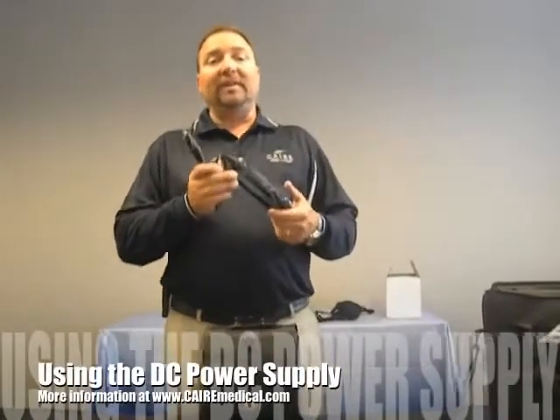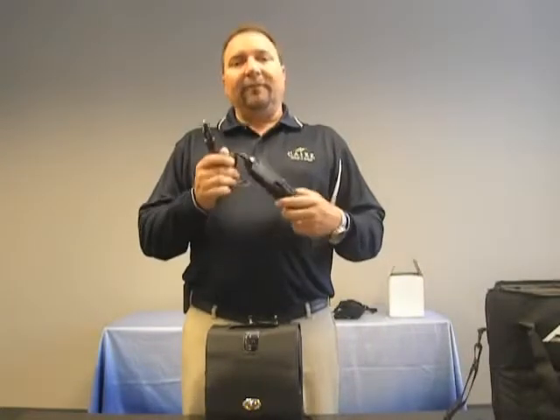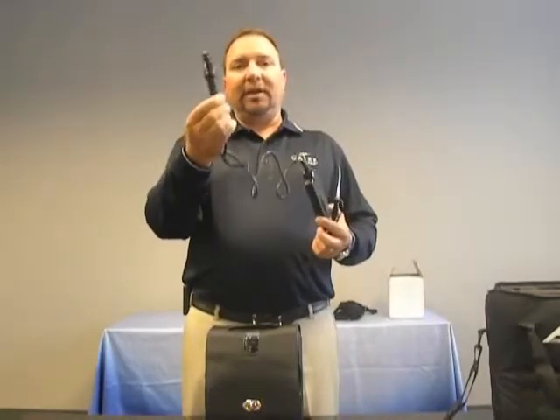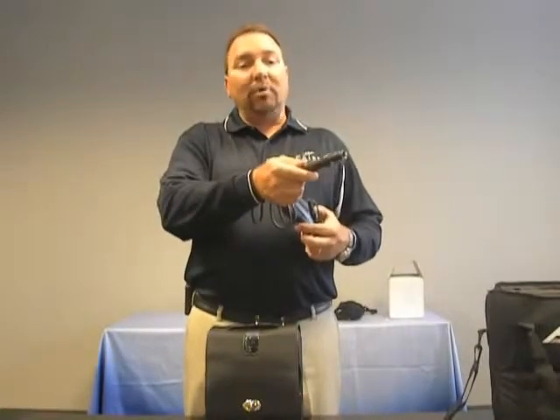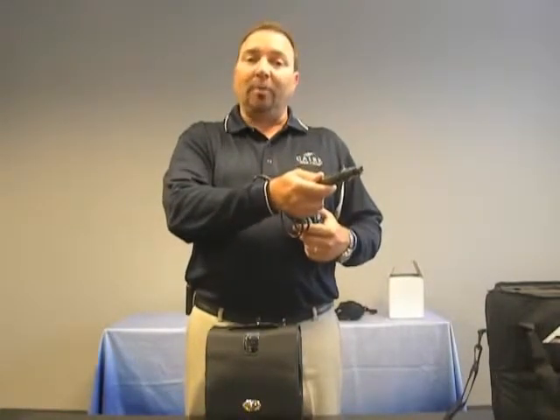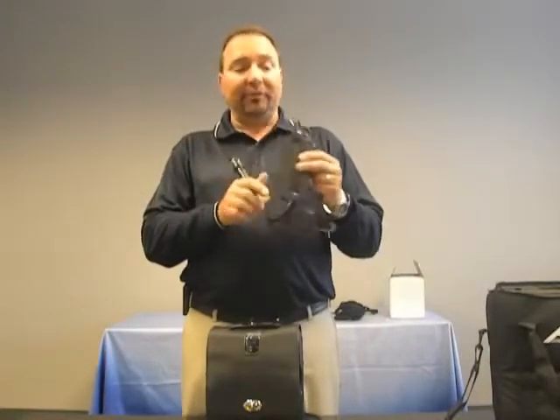The multiple-use DC power supply included with the FreeStyle 5 can provide power in both your automobile as well as airplane. For use inside the automobile, you would simply use it as it is shown here. By plugging the DC adapter into the automobile's electrical outlet, accessory port, or cigarette lighter, it will provide power directly to the power supply. In doing so, you should see a green light located right in the center of the DC power supply, letting you know that you have a secure connection and power is available through the power supply.